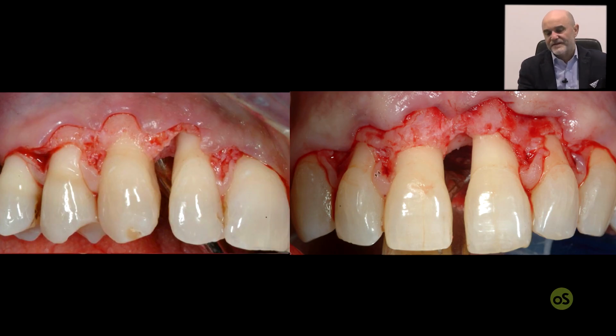While if the defect is located mesial to the lateral or between the two centrals, so it means that we are treating the frontal area, the flap is from 3 to 3, and all incisions at the level of the adjacent papilla are directed towards the midline passing through the interincisors papilla.